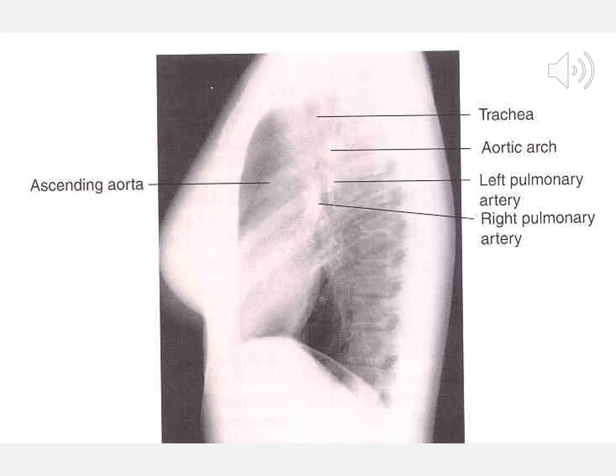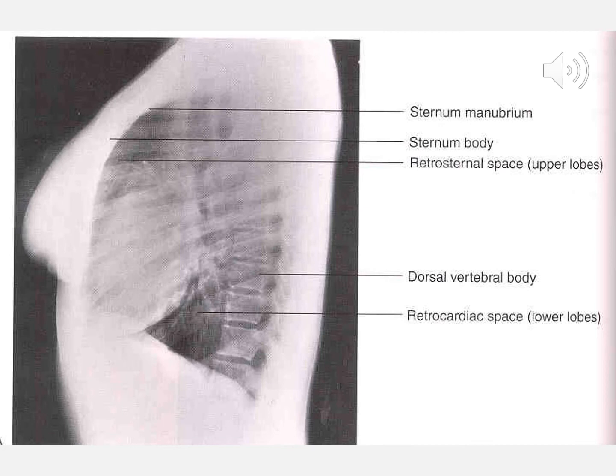A little bit more normal anatomy. Nothing much to say on this slide. Just study it and put it in your brain. More anatomy. Keep reading, keep studying. I know a lot of this seems redundant or repetitive, but it's just easier to break these down on separate slides than to try to jumble all this into one slide and make it real busy. So just really study these as we move forward.